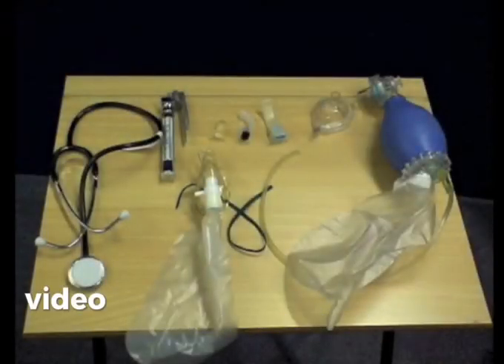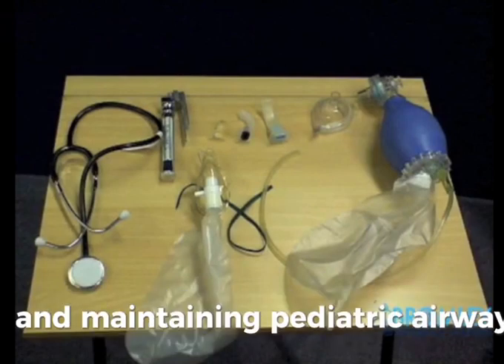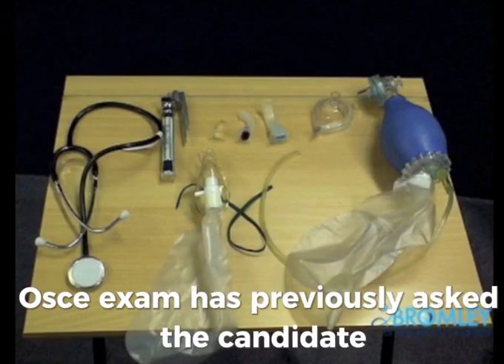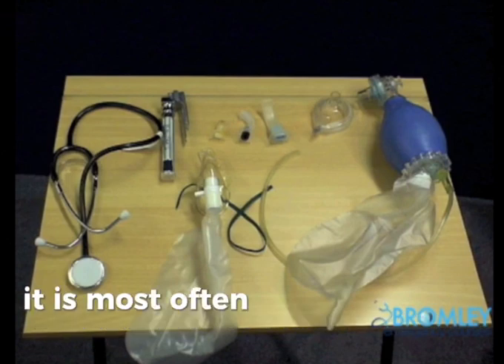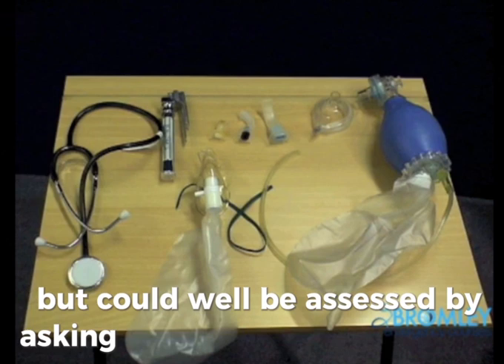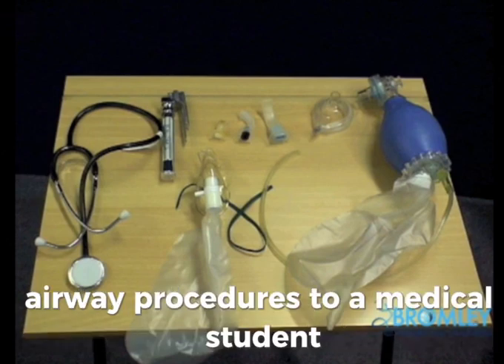This procedure video will take you through the techniques of assessing and maintaining a pediatric airway. The MChem OSCE exam has previously asked the candidate to demonstrate pediatric airway competencies in a number of different guises. It is most often assessed during an APLS scenario, but could well be assessed by asking the candidate to describe airway procedures to a medical student.